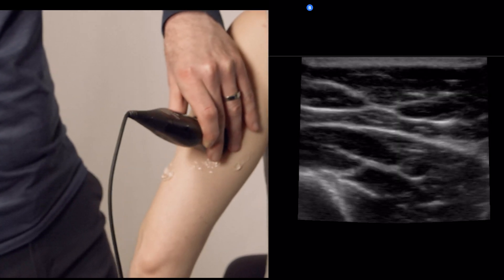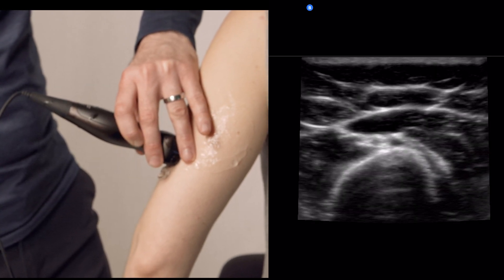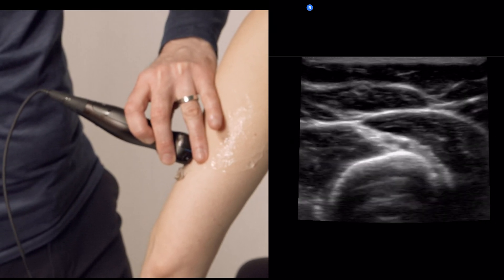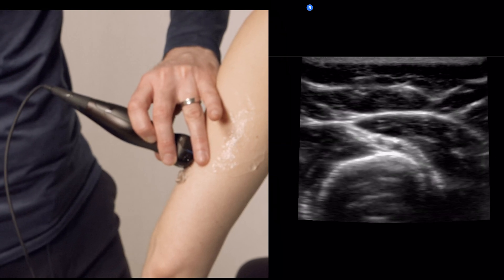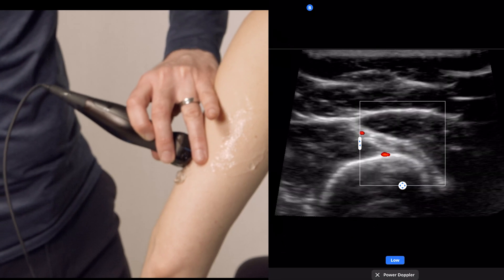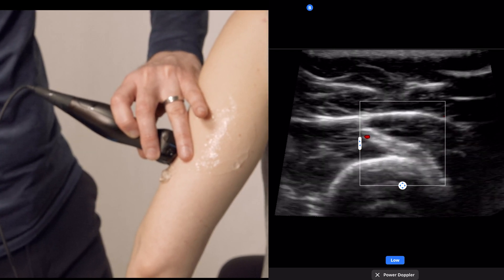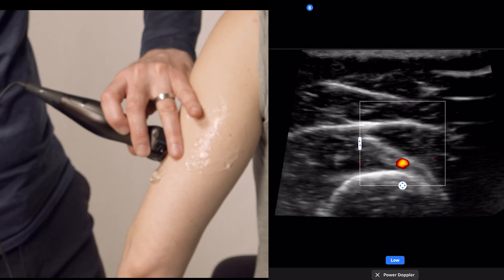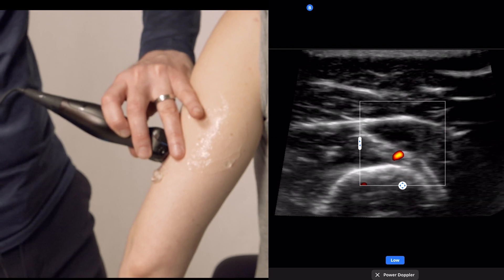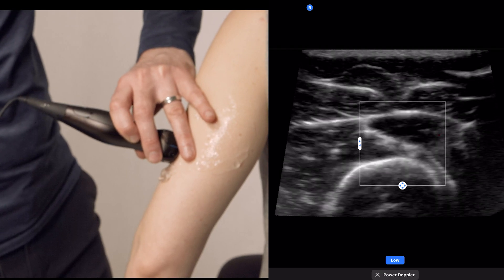We're going to look for our bony reflection of the humerus, then scan proximal and distal until we can see the radial nerve and the artery associated with it. We'll use our Doppler to decide which structure is the artery and which is the nerve. There's also going to be a vein here, which is easily compressed. Here's our artery, and our nerve is just to the left of that artery.